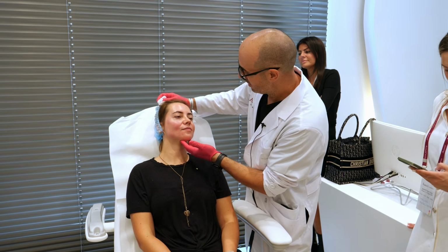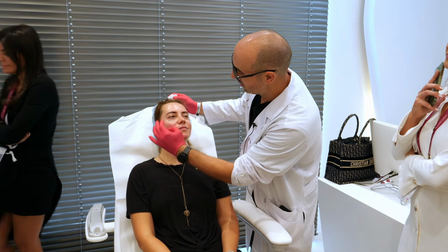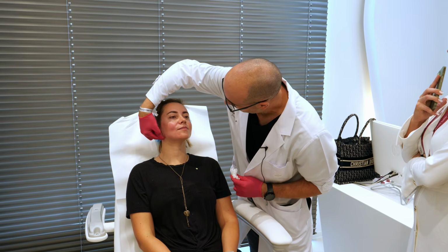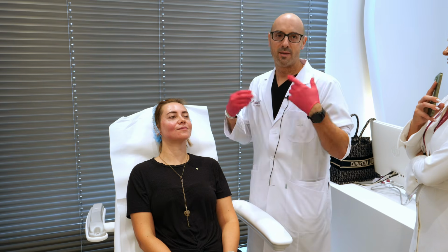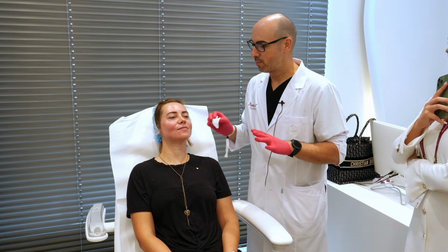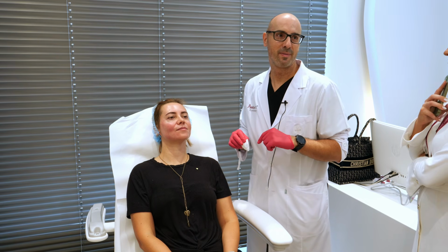And there is a better repositioning of the tissues in the middle third, and you can see better definition of the jawline. In a few days it goes down, and in 2-3 weeks you can see the results. The better thing about this product is that the patient feels the change.